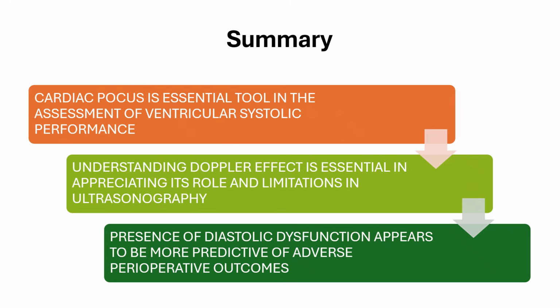So in summary, cardiac point-of-care ultrasound is an important tool in the assessment of ventricular systolic performance, which is true for both left and right ventricles. It is essential for us to have an understanding of the Doppler effect and appreciate its role and limitations in ultrasound. Diastolic dysfunction, when present, appears to be more predictive of adverse perioperative outcomes compared to systolic dysfunction. Adverse perioperative outcomes are defined as hypotension, cardiac ischemia, and pulmonary edema.